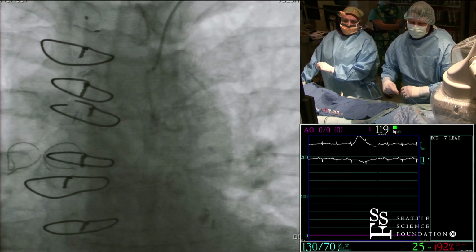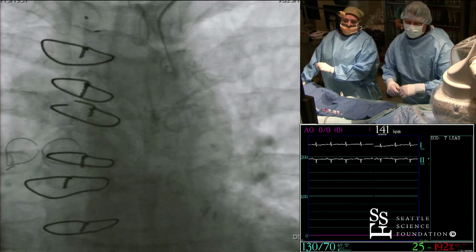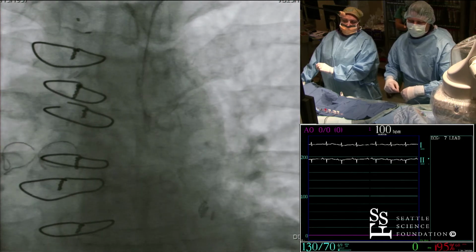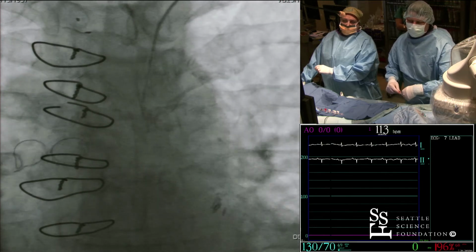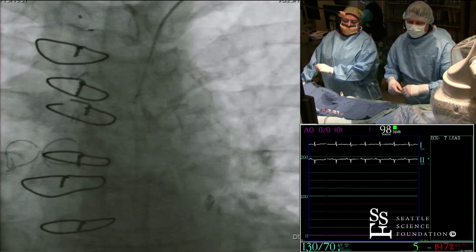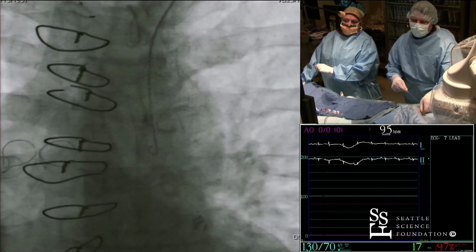In some cases, what we'll do is just get a glide wire to negotiate this. Just needs to rotate a little higher. There you go. Yeah, almost. I think. This is, again, atherosclerosis does this. There we go. Yeah. Okay, take a deep breath in right there. Nope. Go ahead and breathe. Then we have a glide.